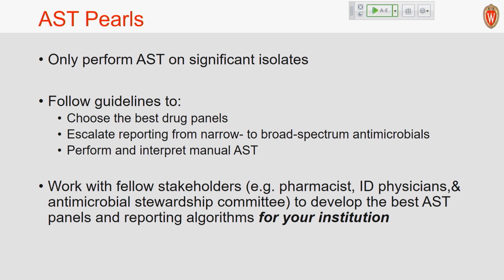Okay, again, we don't want to be susceptibility testing everything. If a physician sees an antibiogram report on an organism, they feel, well, the micro lab thought it was important, I better treat. From an antibiotic stewardship and patient care standpoint, you should choose the best drug panels. You've got a Vitek card or a MicroScan card. Don't report every drug that's on there.